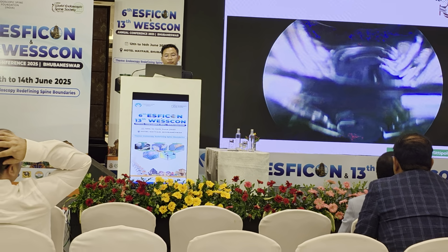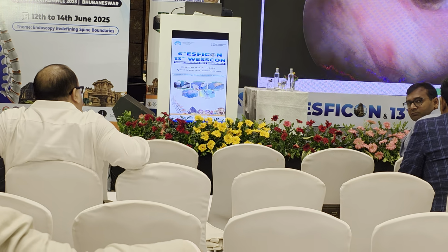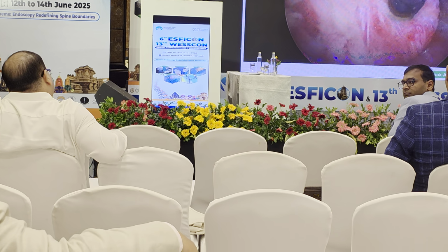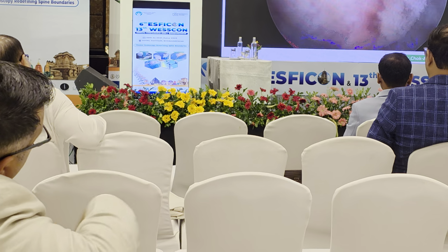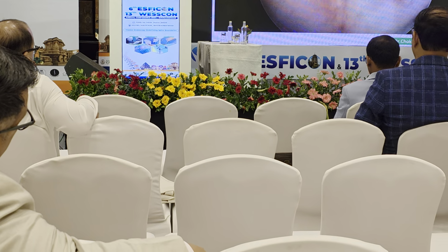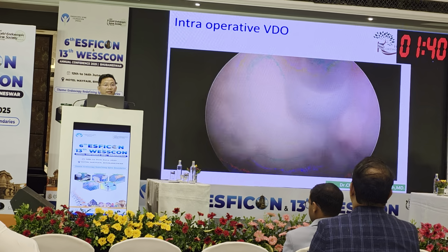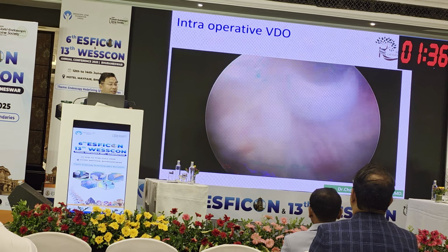I plan to do decompression with the endoscope. This is my video. In the revision case, you have to use the bone landmark, and you try to find the bone landmark first. After that, you identify if the patient has some virgin area.